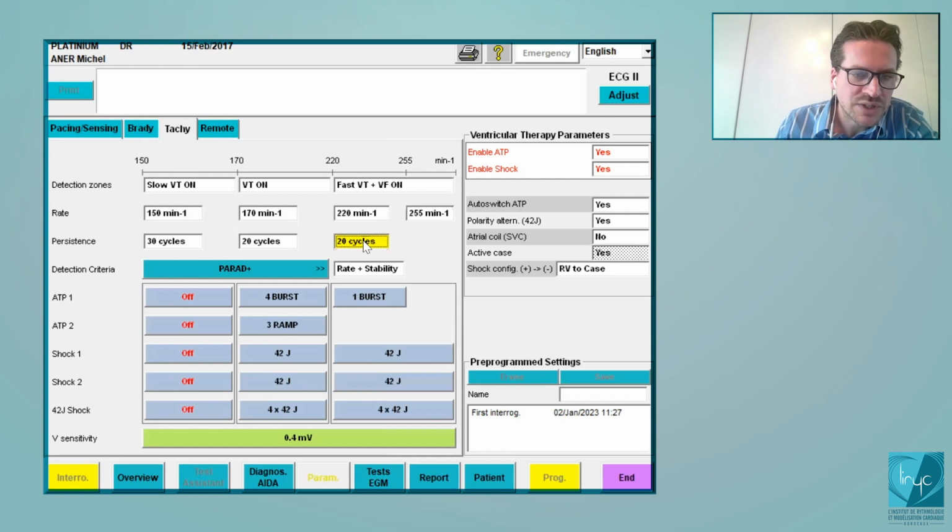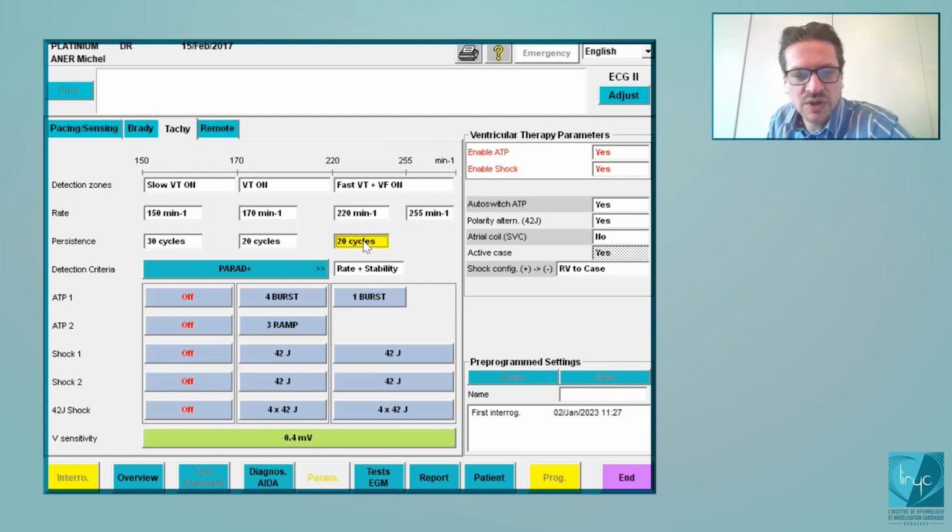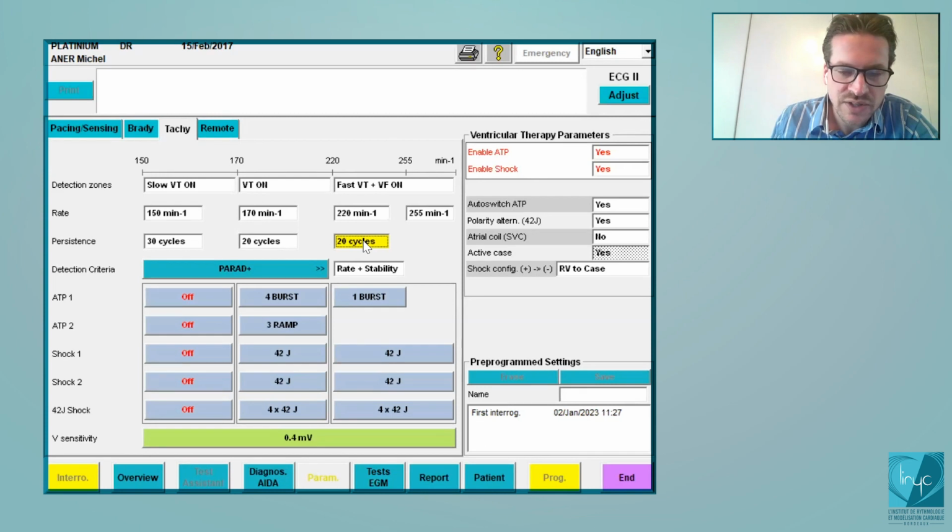It's a bit funny because actually the recommendations today are 20 cycles, the maximum amount of cycles, because we have learned many things the last 10, 15 years, but one of those very important things, which Pierre has mentioned a couple of times, I'm going to repeat it anyway, is that we really try to avoid treating patients when we don't need to. We try to let non-sustained ventricular arrhythmia self-terminate. We don't want to deliver ATP because it can accelerate the rhythms and degenerate into VF. We don't want to charge the capacitors for nothing, because it takes a lot of battery energy.